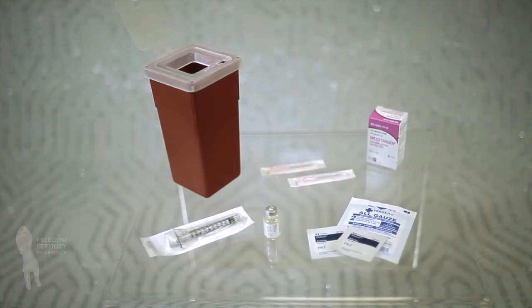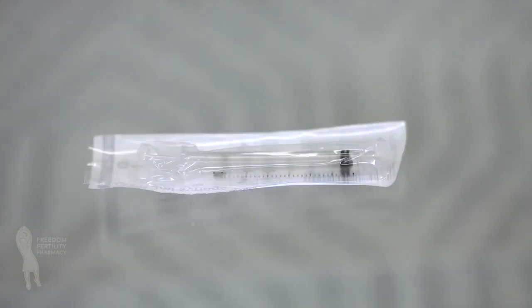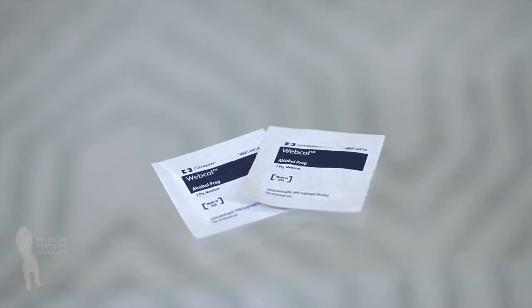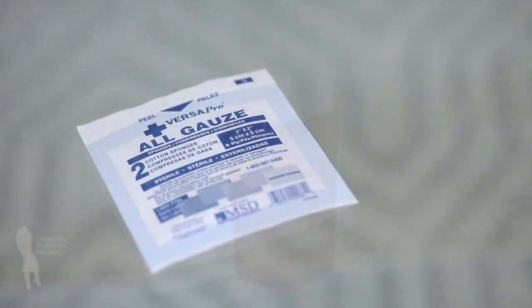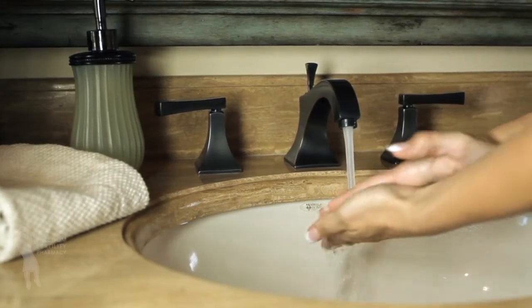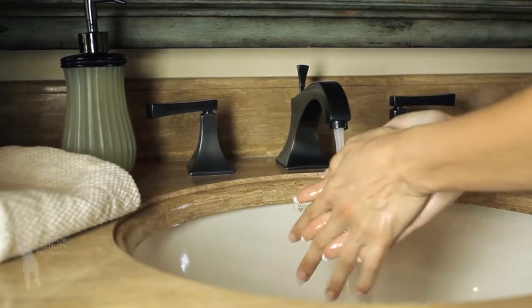Be sure to have all of the following items before you begin: 1 multiple dose vial of Delestrogen or estradiol valerate, 1 syringe, 1 long needle for administration, 1 needle for drawing up the medication, alcohol swabs, sterile gauze, and safety container. Wash your hands with soap and water and dry thoroughly. Make sure you are working on a clean, flat surface.